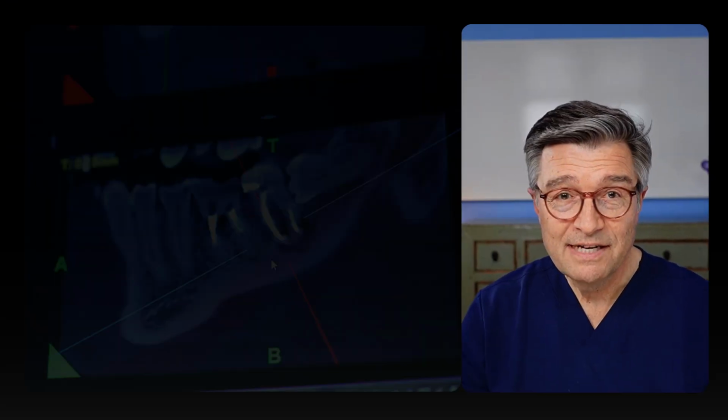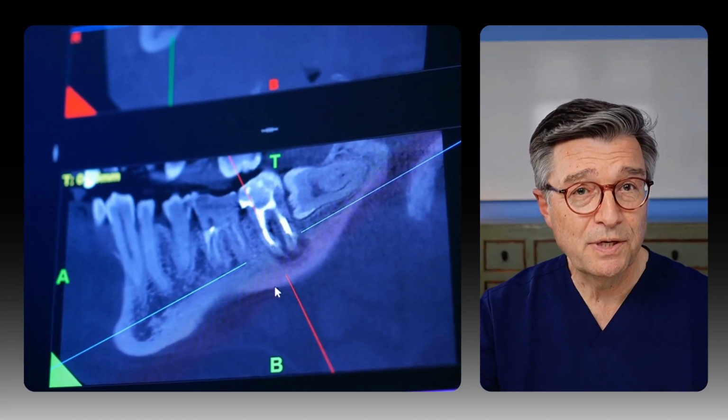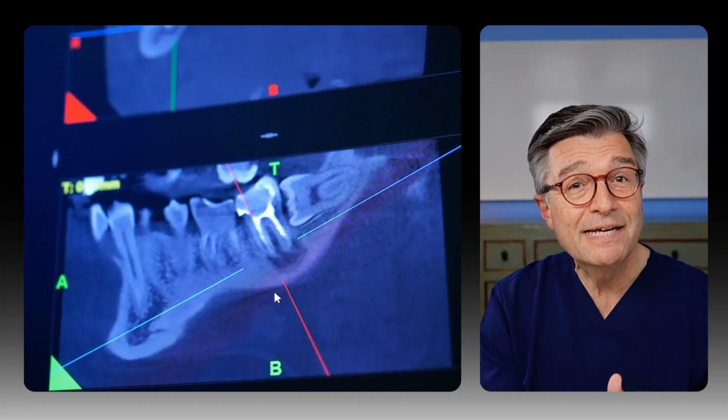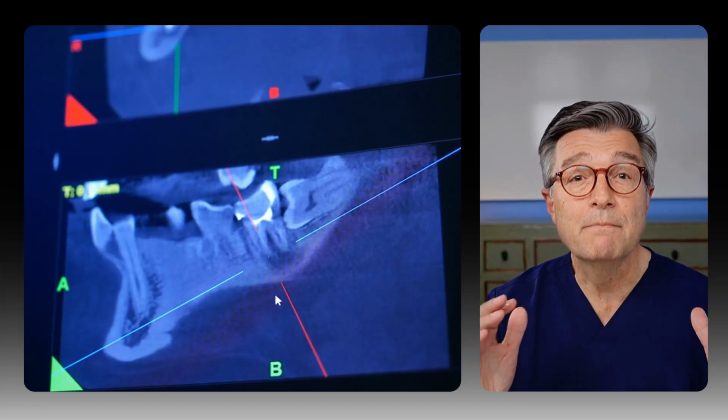In this episode, I want to walk you through the complete visual diagnostic workflow. We call it look, scan, shoot, diagnose. And here's how it works step by step. Let's start with the X-ray, 2D or 3D. This remains the starting point. We use it to look through the patient, evaluating hard tissues, bone pathologies, implants, impacted teeth, and more.